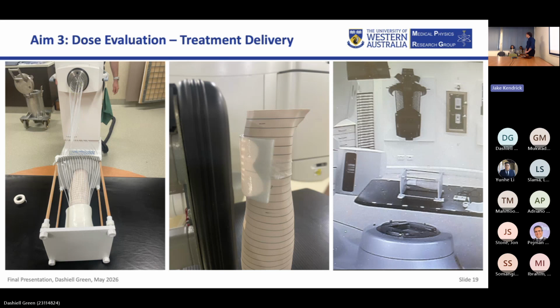Like, the Electron bolus probably could extend a couple of centimeters further at the edge, around the arm, or maybe up and down in this photo. Would that have affected the results? I guess which were the main pieces of film that you were taking?